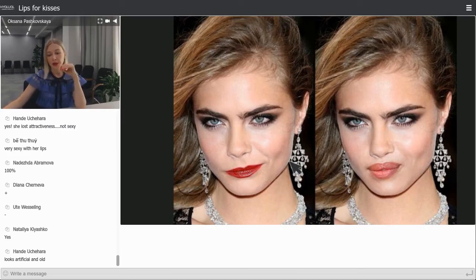Pay attention to their jawline, because very often those faces need just volume in the tip of the chin. When we put in the volume and increase the tip of the chin, the menton, yes, we make that face more fit, and we really harmonize the face in such a form. So please, I recommend you pay attention to this. It's very easy to achieve that result, a fit and younger profile, but pay attention, because not only the lips could be injected.